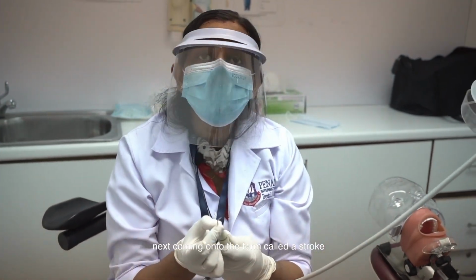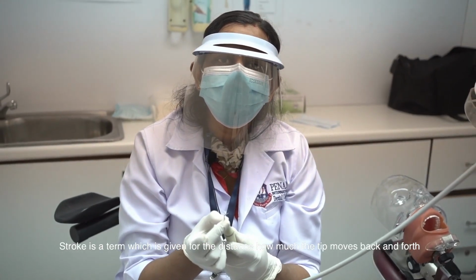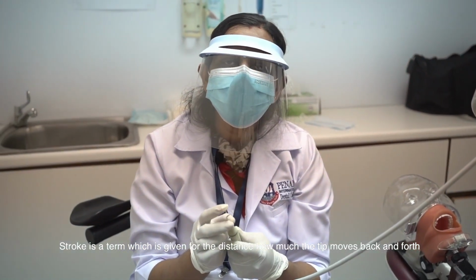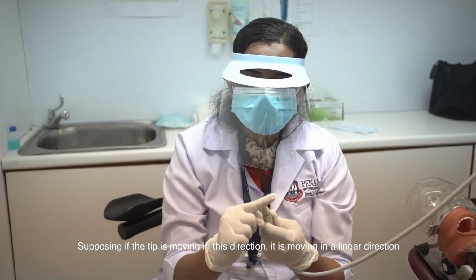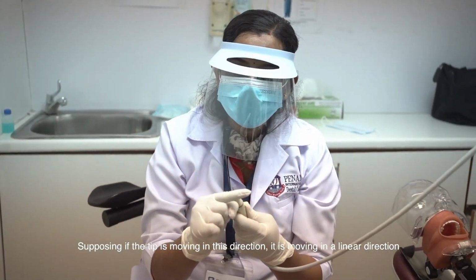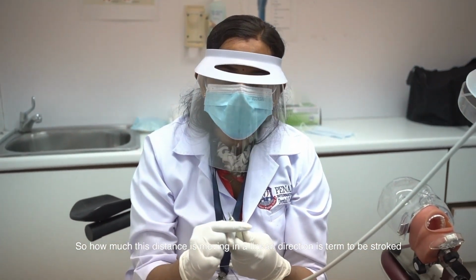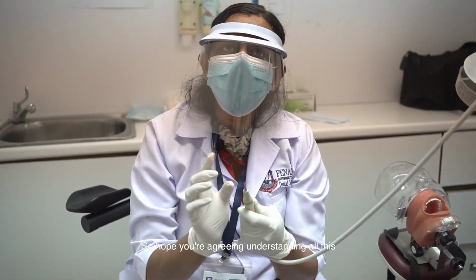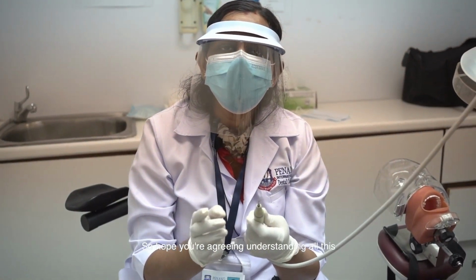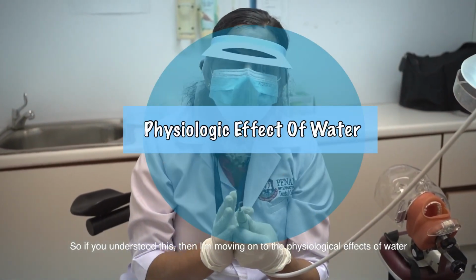Next, coming on to the term stroke. Stroke is the term given for the distance the tip moves back and forth. If the tip is moving in a linear direction, the distance it moves in that linear direction is termed the stroke. Half this distance is termed the amplitude. So I hope you are understanding all this. If you have understood this, then I am moving on to the physiological effects of water.